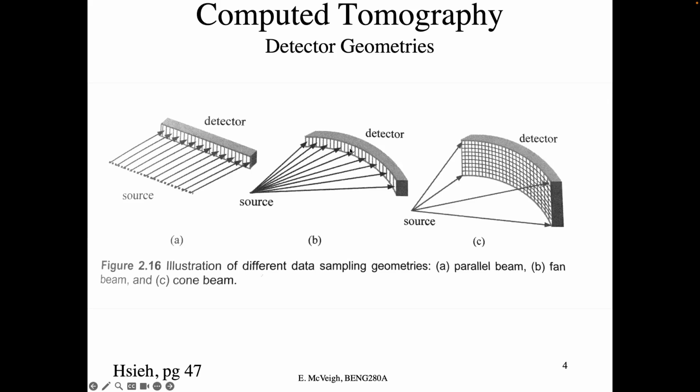And the geometry that we're working with in the modern day for the problem we're going to look at looks like this. We'll only look in 2D for analyzing this stuff, not in 3D. There'll be detectors separated by a constant separation, about 1 millimeter. And we'll decide how many angles to take with this source detector pair.